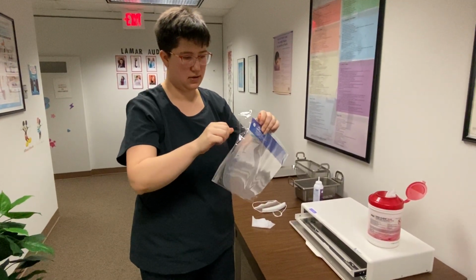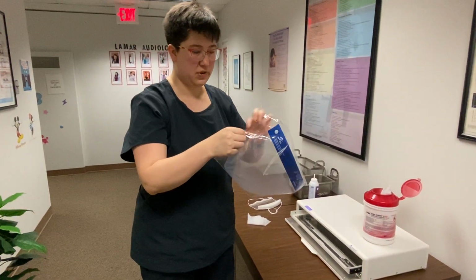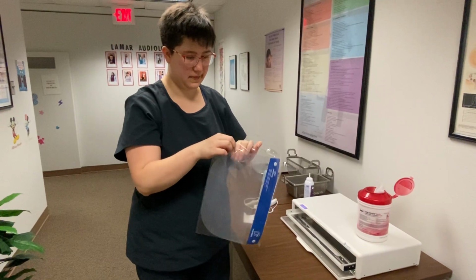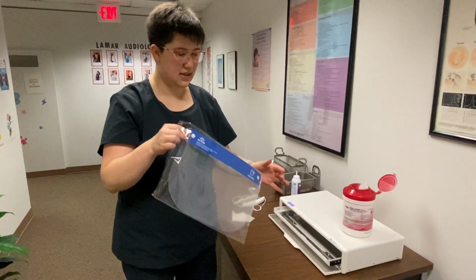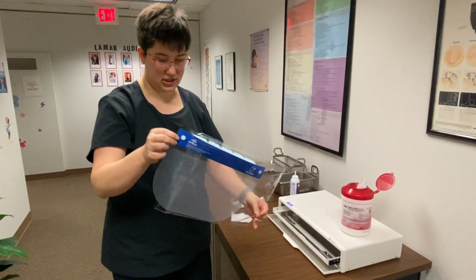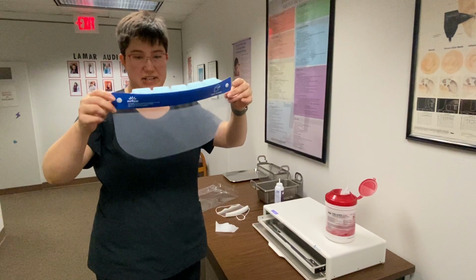And you will need to keep up with your shield and keep it clean as well. It's going to be the same sort of situation. Wipe it all down.